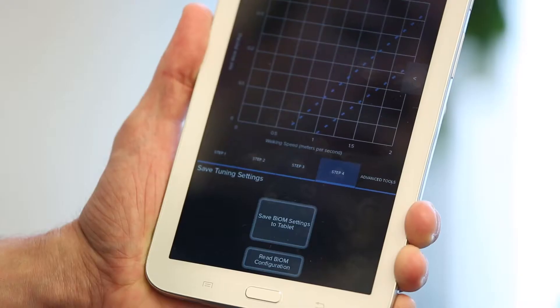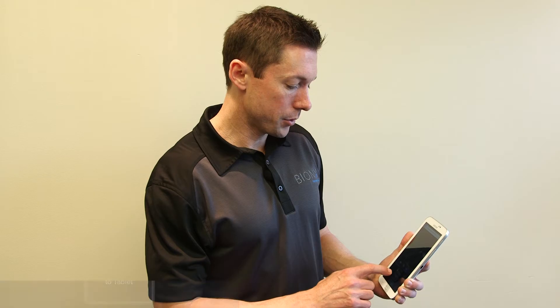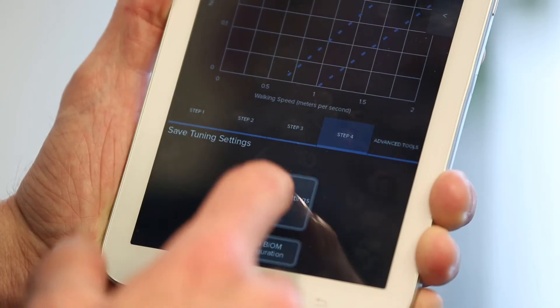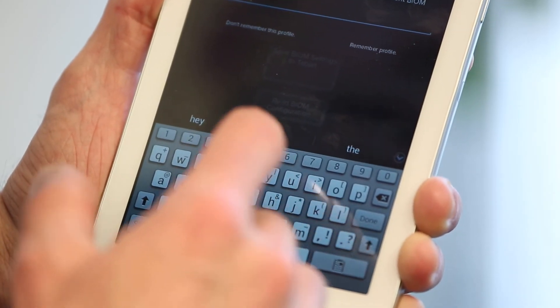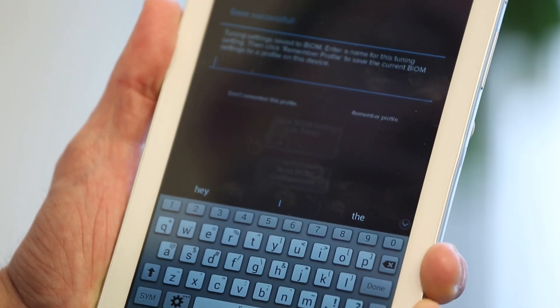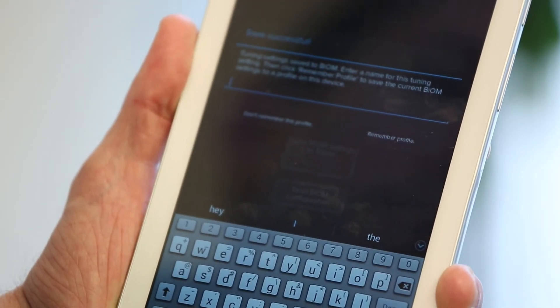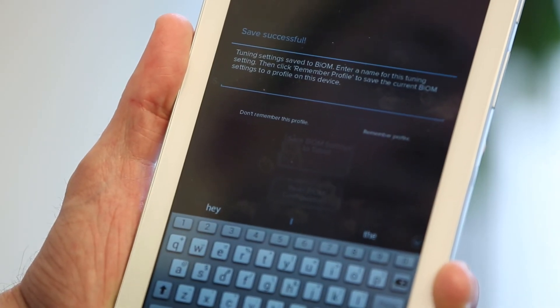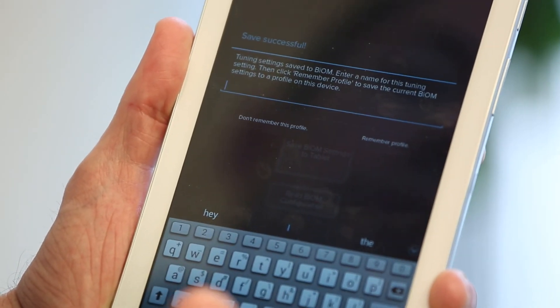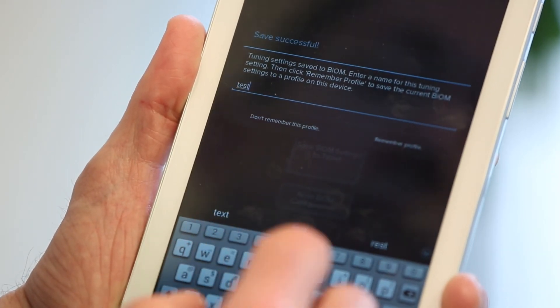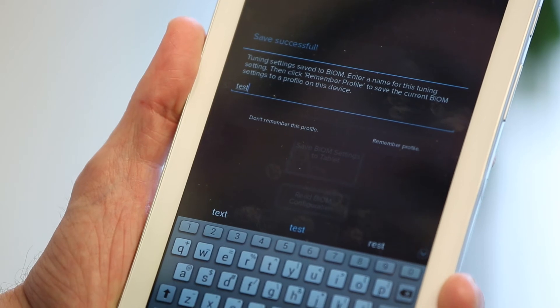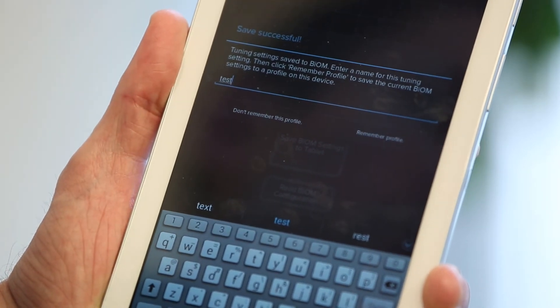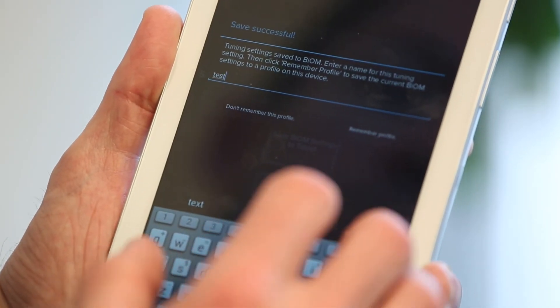Step four, you will save the settings to the tablet. We choose the button that says Save Biome Settings to Tablet, and then this is going to ask us to create a file name. There is a timestamp automatically applied to this name, so you don't need to put a date in. You'll assign a name to it. For example, we'll say test, and then you would simply choose Remember Profile, and that would save those particular settings for that patient to the tablet.